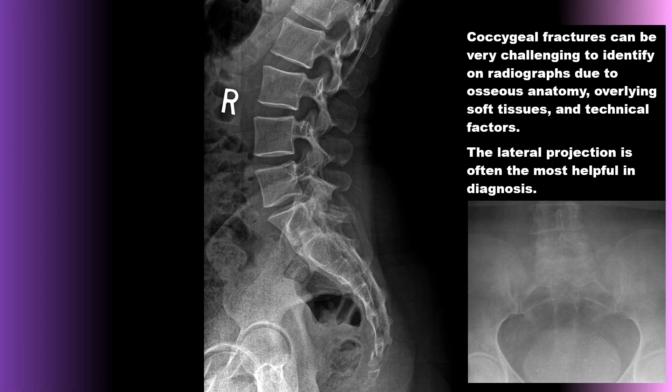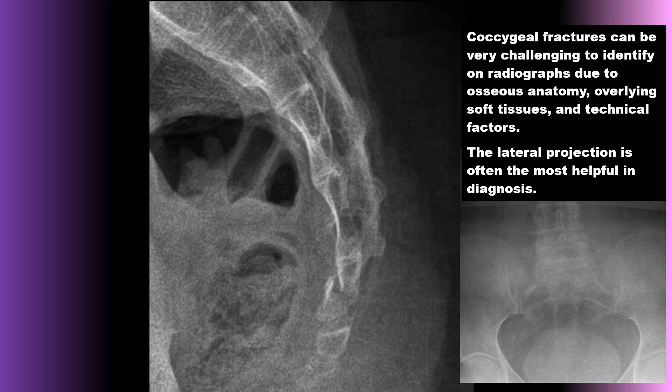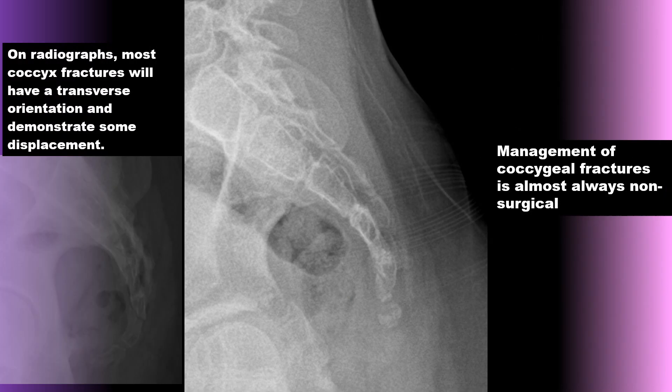Coccygeal fractures can be very challenging to identify on radiographs due to atypical osseous anatomy, overlying soft tissues, and technical factors. The lateral projection is often the most helpful for visualizing the radiolucency and seeing the fracture and any displacement. On radiographs, most coccyx fractures will have a transverse orientation and demonstrate some displacement. Management of coccygeal fractures is almost always non-surgical.